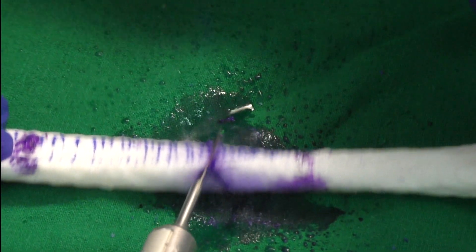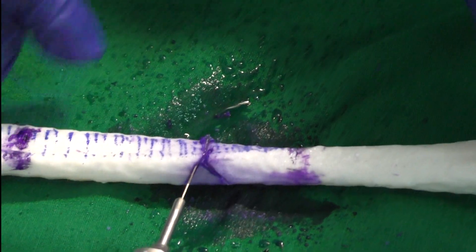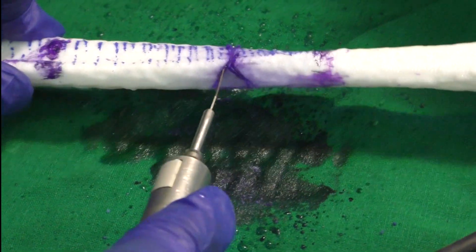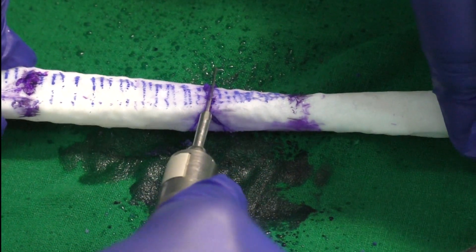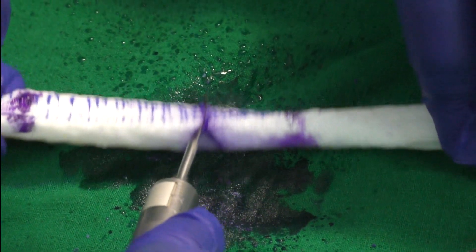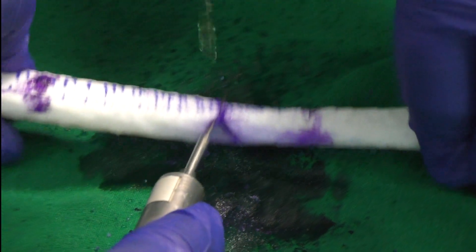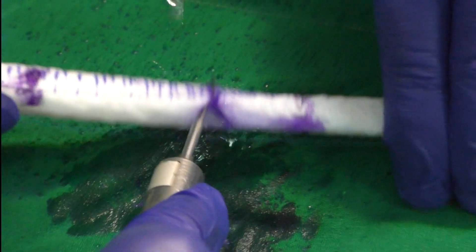Forgive me for the time it takes to do the osteotomies as I mentioned. This is not real bone and it does take a bit to cut the osteotomy or the wedge out.